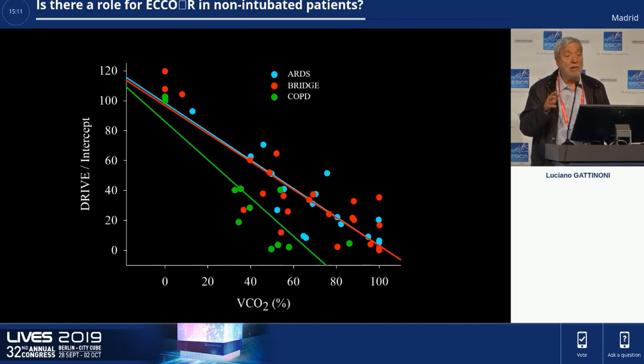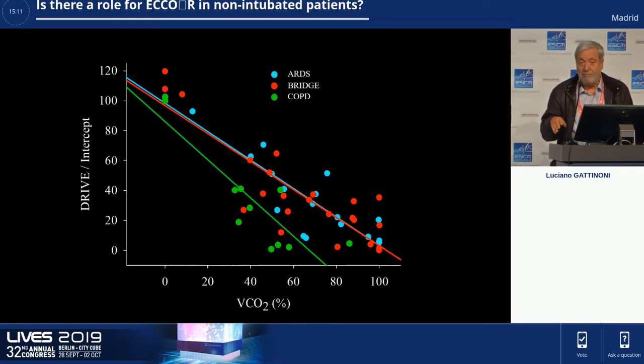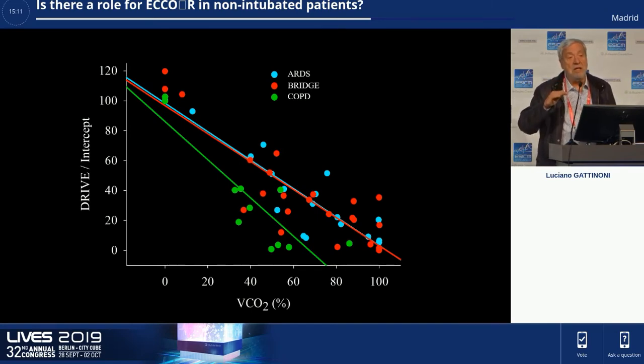A possible risk is hypoxia, because if we do not breathe and we don't have enough oxygen, the alveolar PO2 goes down. But for these patients, CO2 removal and spontaneous breathing is okay. The patients with asthma or with hyperinflation: I think it is a very good system. I was looking at non-invasive ventilation and so on.